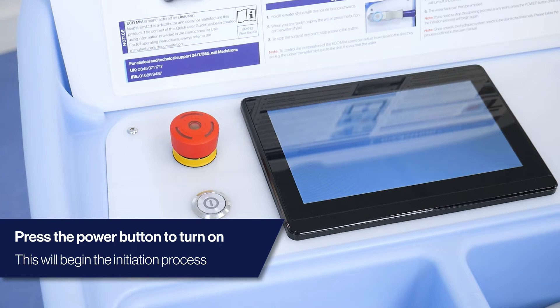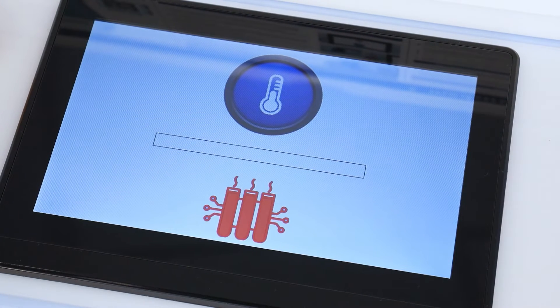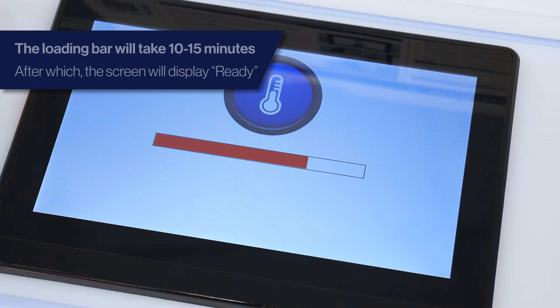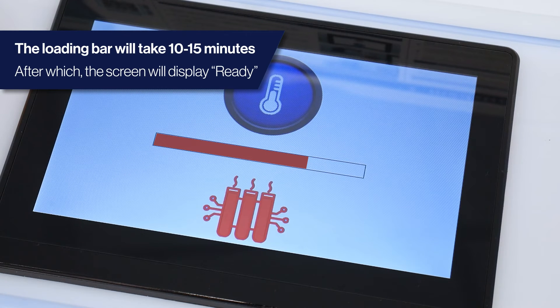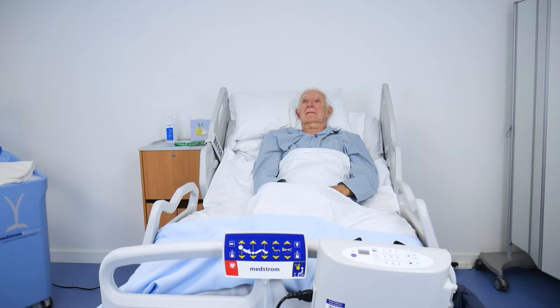During initiation, the digital screen will show a loading bar for 10 to 15 minutes whilst the device is heating. When the device has completed initiation, the digital screen will read 'ready', indicating it is now ready for use.